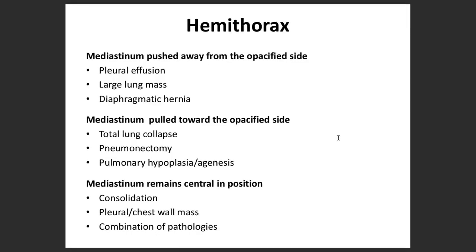So now you are able to understand not just how to differentiate ARDS, but also the different causes. For example, is it caused by a lung problem, or is it caused by something else?